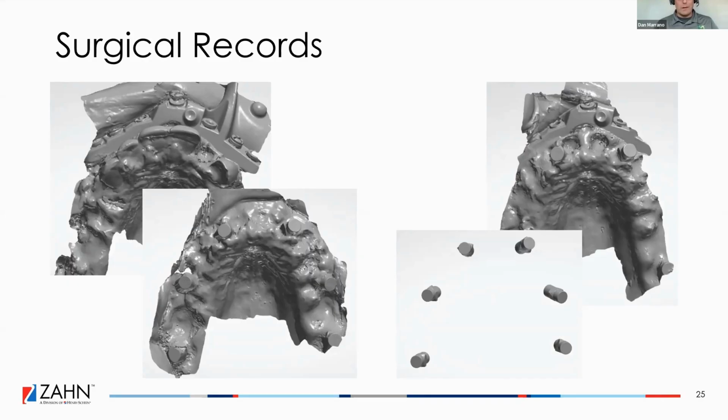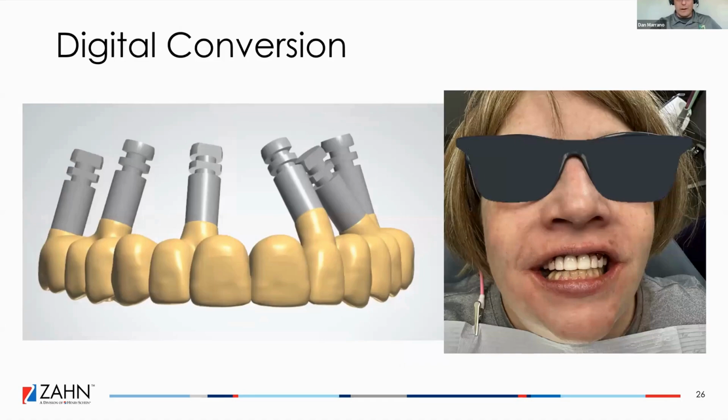So as we jumped through the scan with that, we kept using that to stitch our scans together. And at the very end, we got our iCam. And here was what she looked like when she left that day. That was our digital conversion, and that was her walking out that same day. I mean, that looked really good.